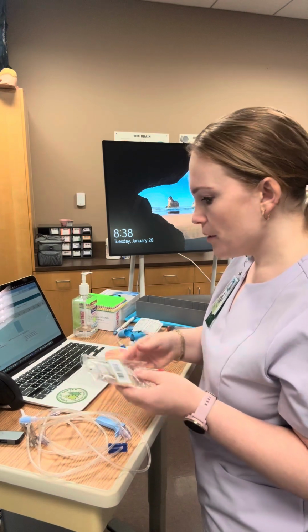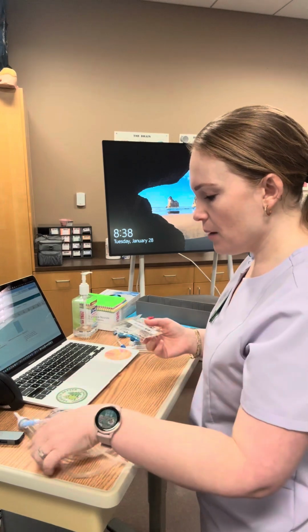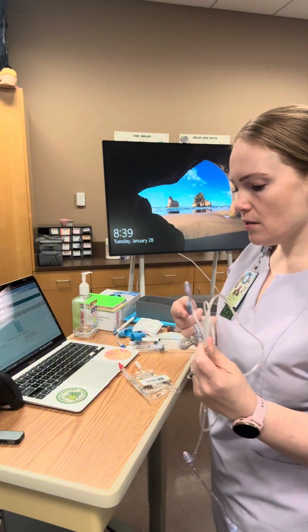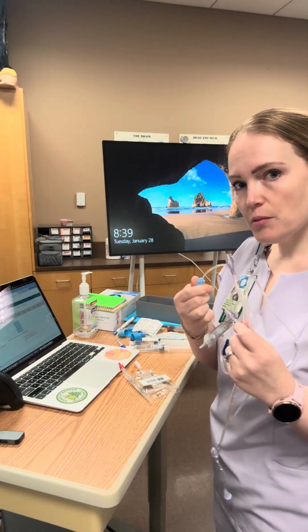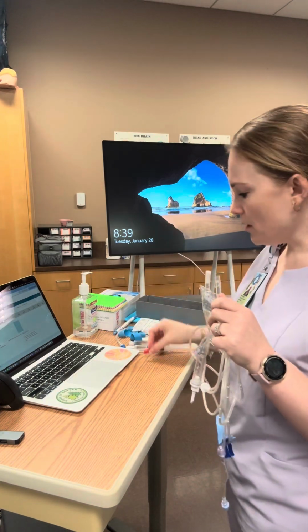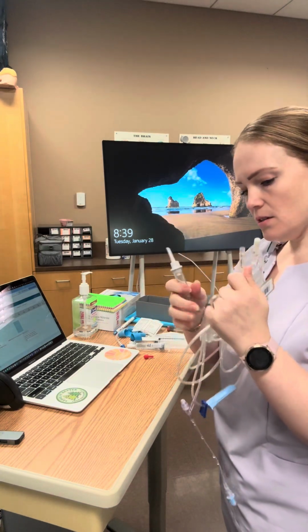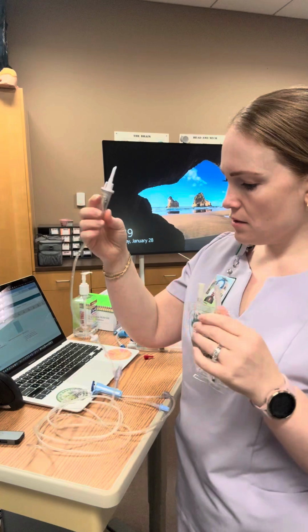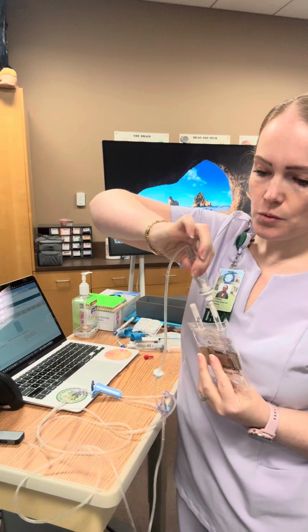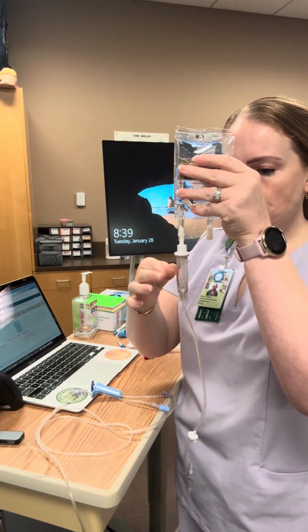Okay, so now we're going to go ahead and get ready to prepare this medication. So I have my fluids. I'm going to grab my IV tubing. And so I'm going to clamp my IV tubing here all the way down with the roller clamp before I begin. And I'm going to pull this upside down. I'm going to pull off that. I'm going to take off the piece here. Careful to make sure that nothing is getting tangled. I'm going to insert this inside. And I'm going to squeeze. This is how I do it. Squeeze, flip over, fill up the chamber halfway.